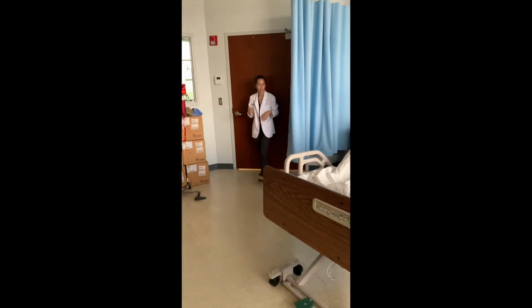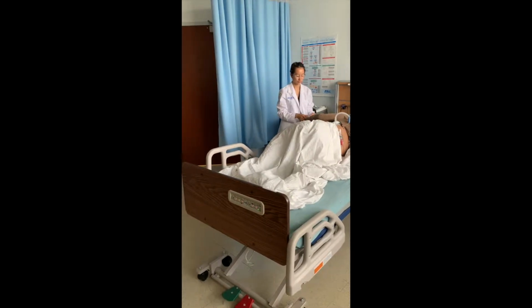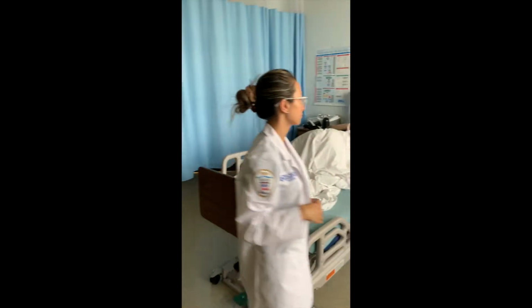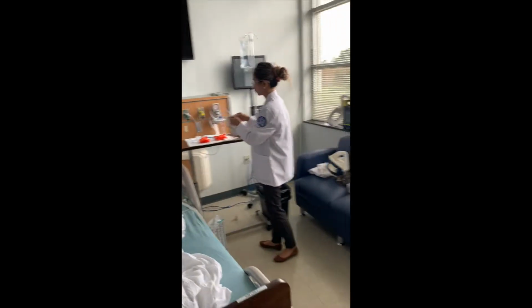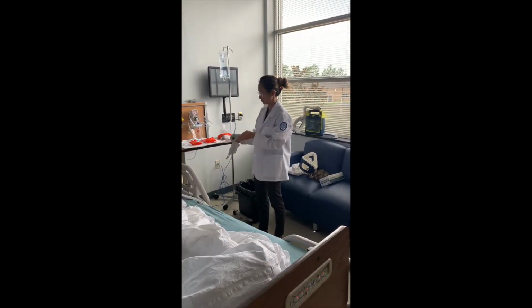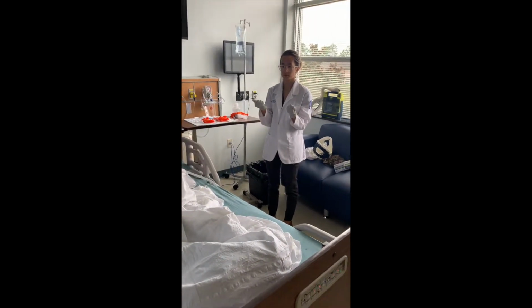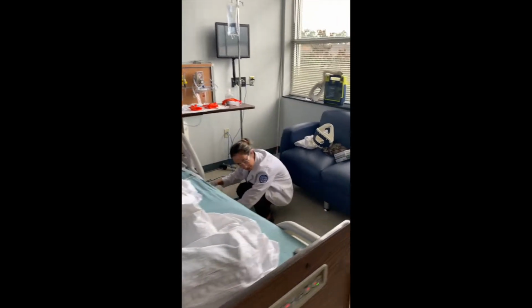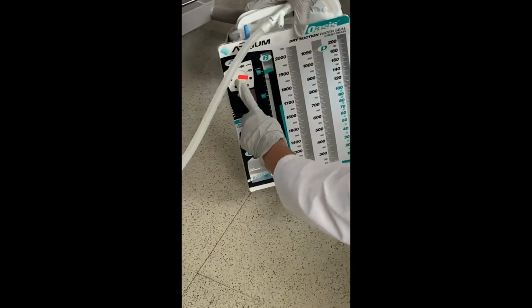Enter the room and introduce yourself to the patient. Perform hand hygiene and identify the patient using the 2 patient identifiers. Provide for privacy. Don PPE. Visualize the chest seal drainage chamber and ensure there is no leak in the air chamber by observing that the orange suction control bellow is at the triangle mark.